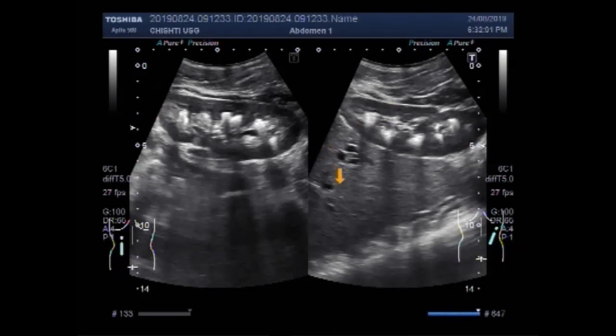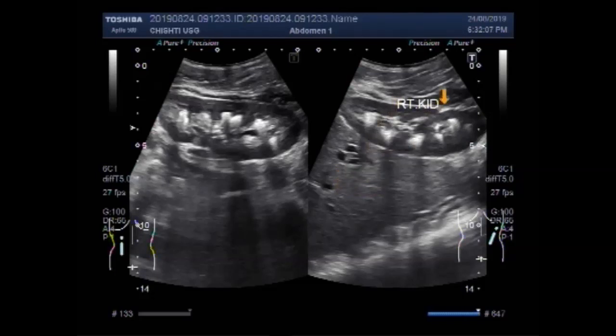This is the liver, and this is the right kidney. This is the left kidney. This is the liver.